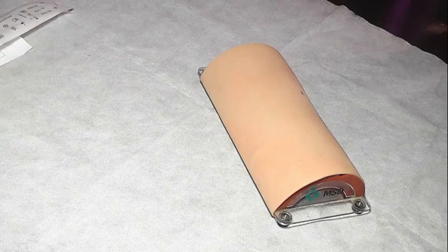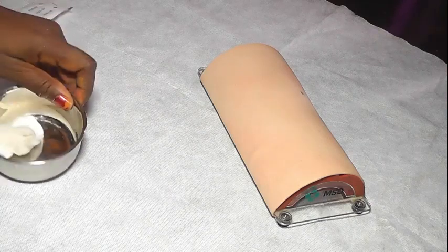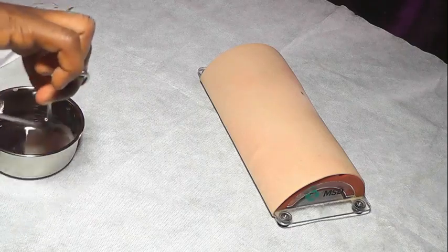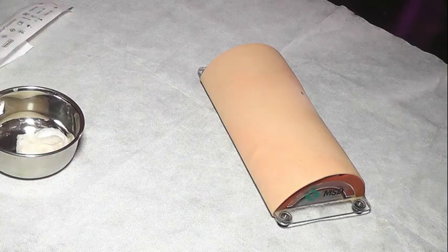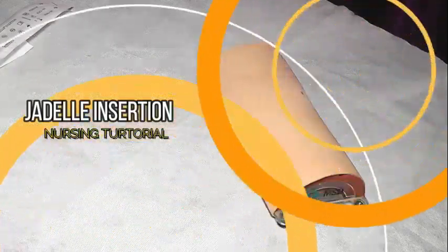Then we also need a gauze soaked in an antiseptic. So we're going to be using this. And then I have my artery forceps. Then of course sterile gloves.